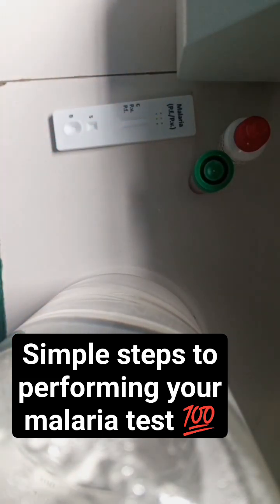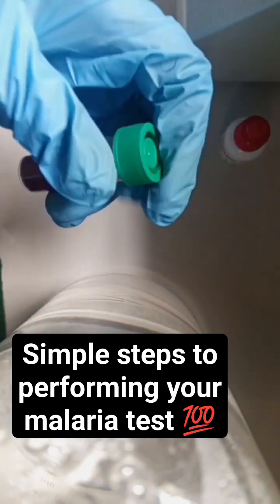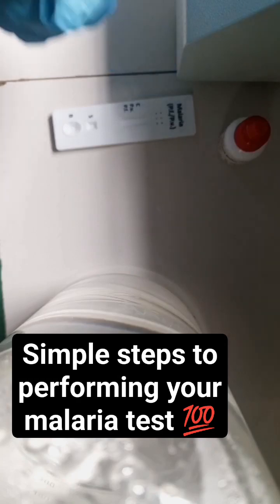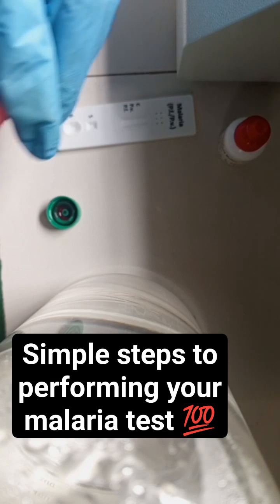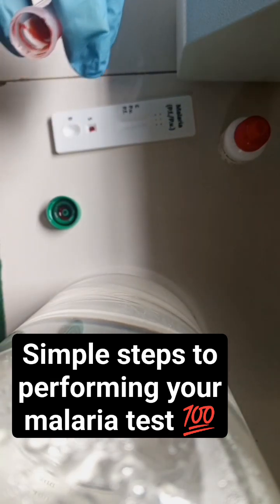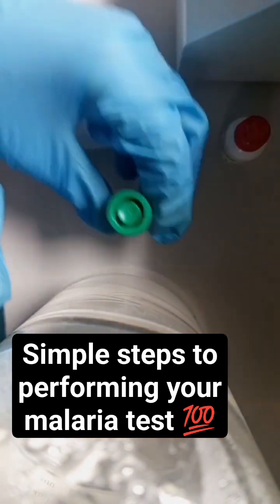Let's go with 12 so we can actually pick something up. This is the sample — you have to mix it very, very well. Then you open it and pick just a little drop. You can use a pipette, a smaller pipette, or a Pasteur pipette — any can get the job done.